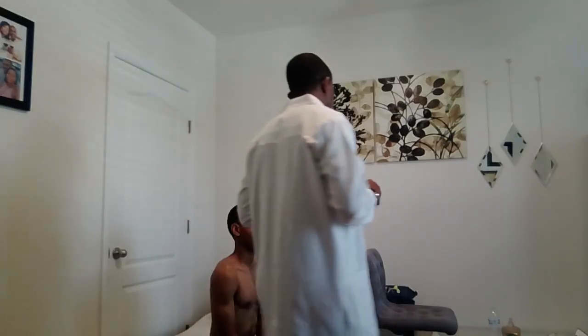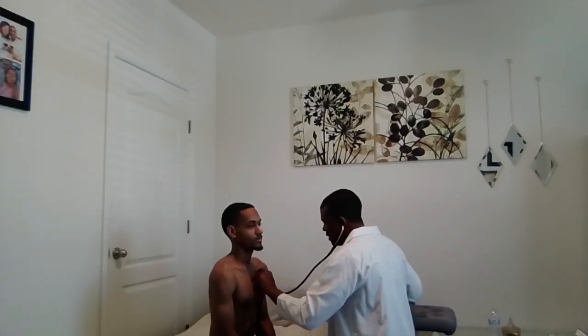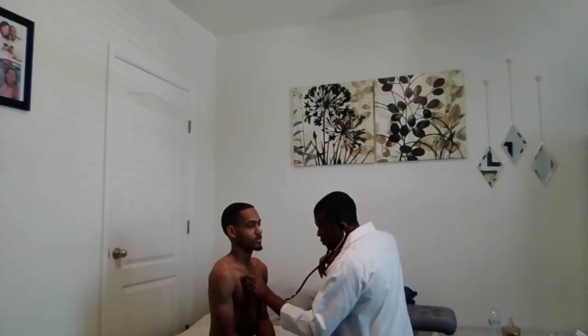Excellent. Now, Frank, I'm going to listen to your heart. I'm going to listen to the aortic valve in the right second intercostal with both bell and diaphragm. Excellent. I'm going to listen to the pulmonic valve in the left second intercostal, with both bell and diaphragm.